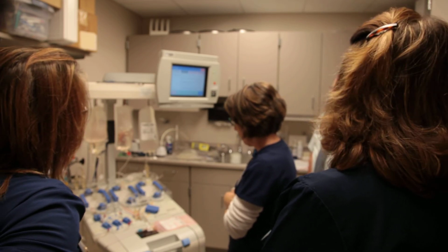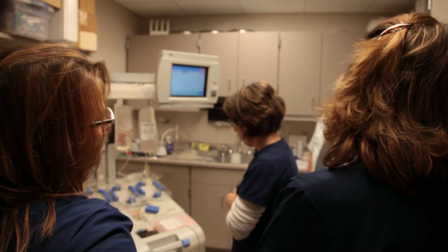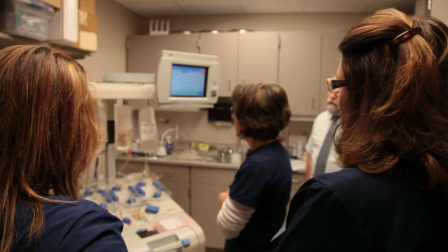The only time I can think that you would do that is if there was some rare type of blood and they only had a small unit, because that's all they could use on the patient, and then you'd want to stop it. You then run air into it.